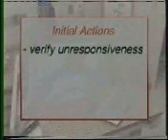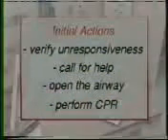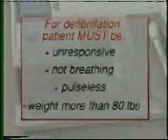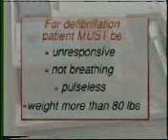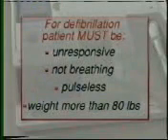So on encountering an unresponsive patient, the initial actions by the first responder are to verify unresponsiveness, call for help, open the airway, and perform CPR while the ZOLL is attached. It is very important to note that automatic external defibrillation is not indicated unless the patient is unresponsive, not breathing, or only agonal respirations are present, pulseless, and weighs more than 80 pounds or 36 kilograms.